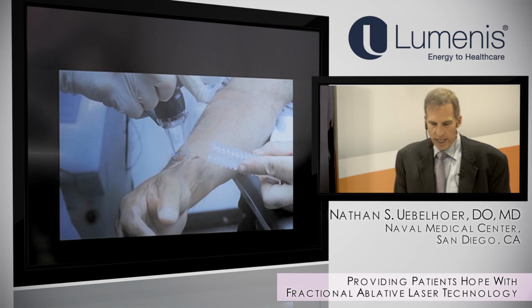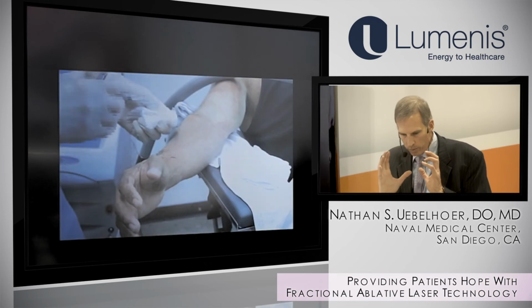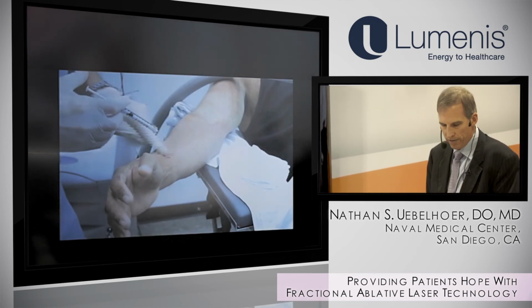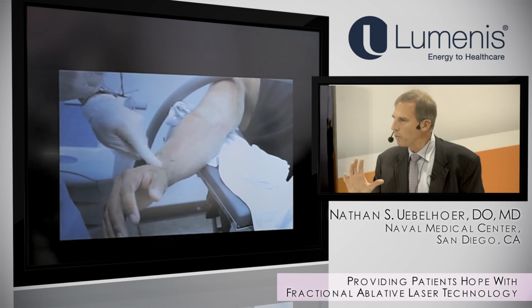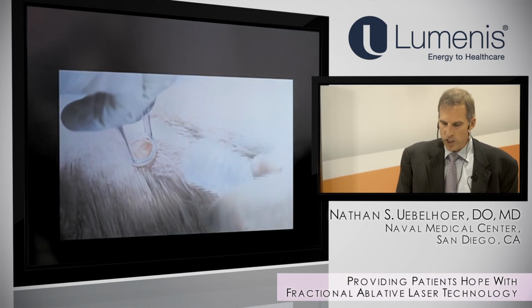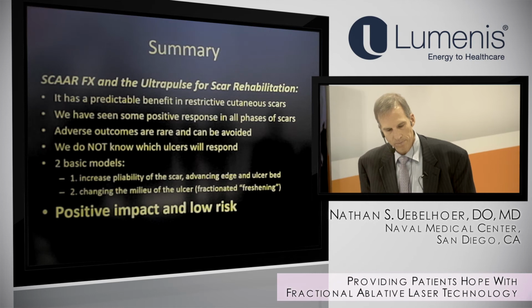But here we are, lasing then. We do a small area. Again, we're not trying to make these perfect right next to each other. We're just treating a small area, then we cover it with Kenalog afterward. And then we go on to another area and slowly treat through that vector of where the most restriction is. And not trying to treat the whole scar at once, although sometimes we do. Usually we're just treating small areas.